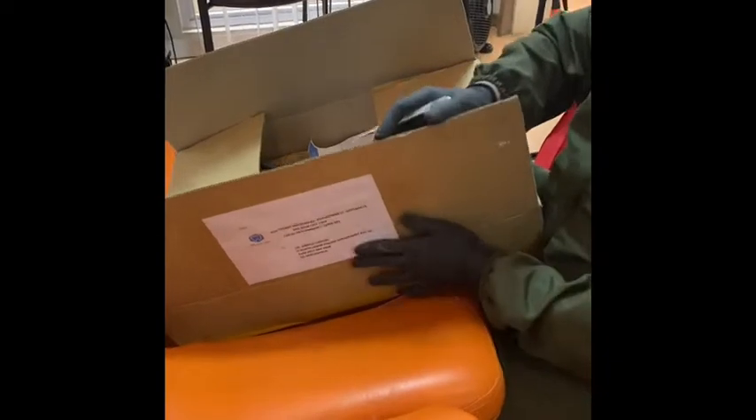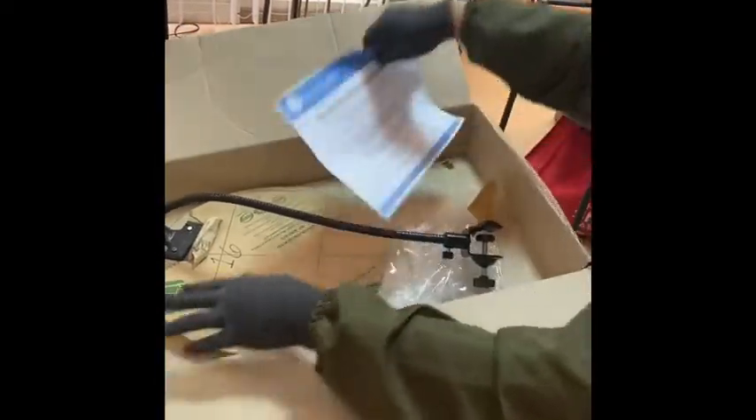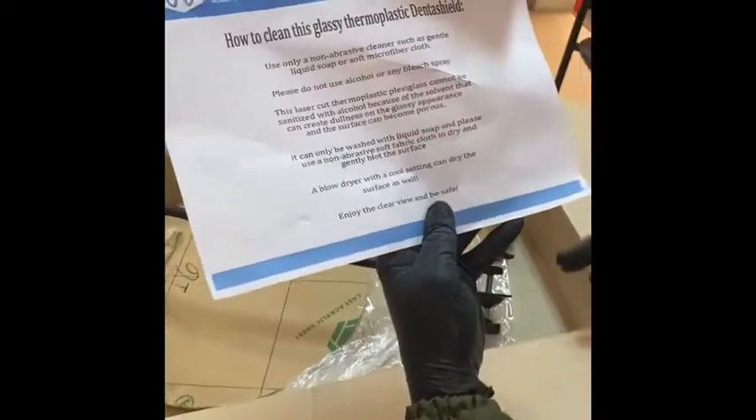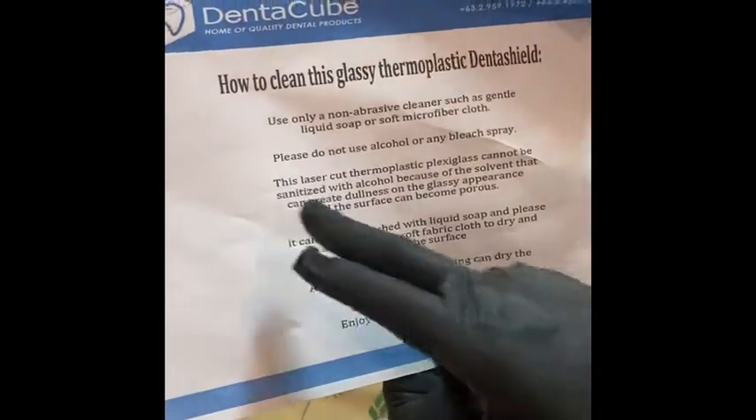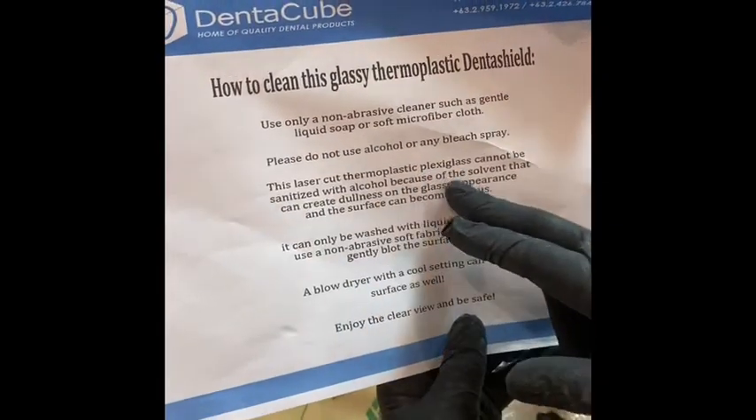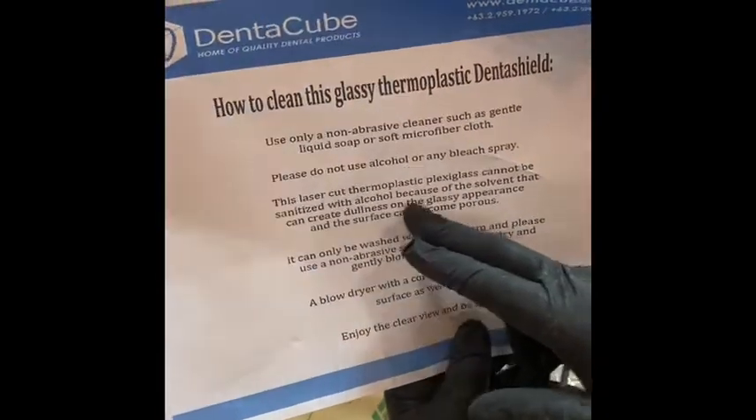This one came from Dentacube. It's a shield made of thermoplastic material. It comes with instructions — hindi ka pwede gumamit ng alcohol or any bleach spray. Laser-cut thermoplastic plexiglass cannot be sanitized with alcohol because of the solvent.